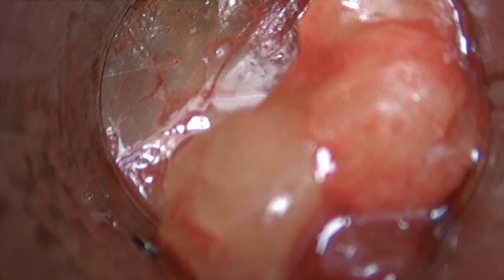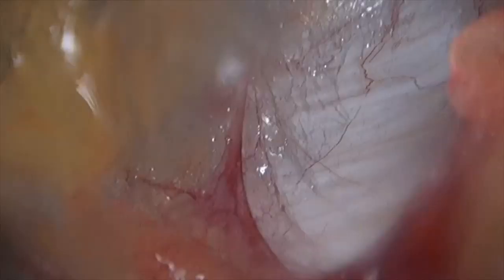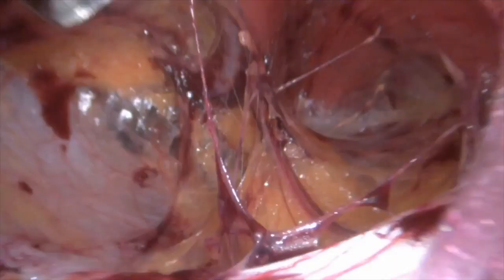So now under vision, we insufflated the gas. You could see how the space started opening up. The first thing we would want to do is identify the posterior rectus sheath, similar to a TEP repair. And then we can carry our dissection in a telescopic manner. And whenever we do the telescopic dissection, it should be in a forward-backward movement and no sweeping motion. Here you can see the rectus is slightly bare. So once again, we identify the posterior rectus sheath and we dissect close to it. So this is the key, and we make the working port.